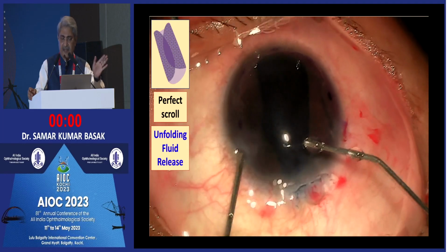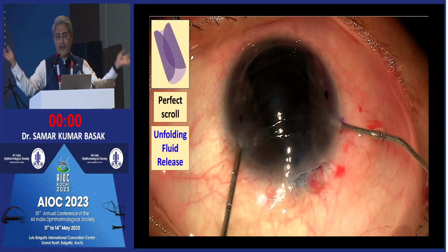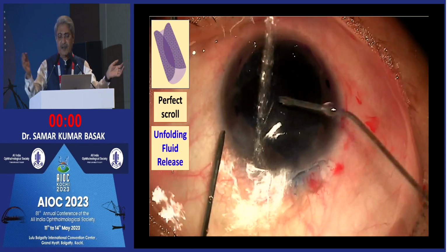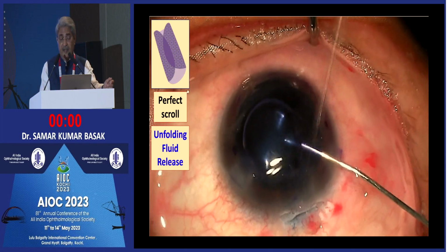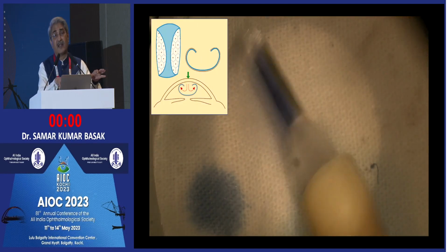Just fix it, no tapping. Both sides you release the fluid, and both sides it will open like this. You see, it is opening. You do just a little bit of movement, not that much of a samba dance kind of tapping. The air injection I will talk about in one line later. And suppose this is just reverse. It is just reverse, sorry.